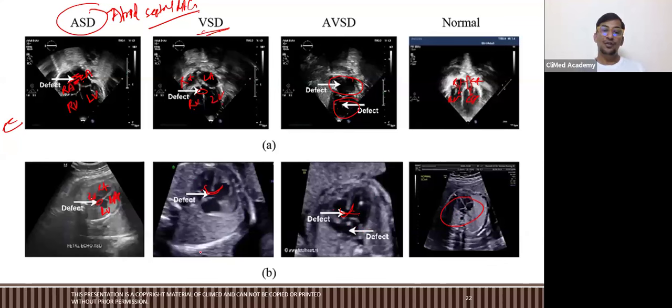With the help of echo, please differentiate thrombosis or embolism. Thrombosis is a clot which is not floating. And embolism is the moving clot, which is moving in the circulation. Okay, moving in the circulation, that can travel.